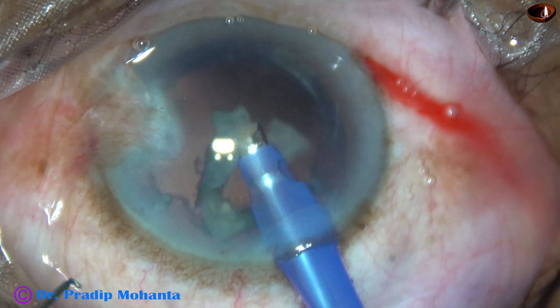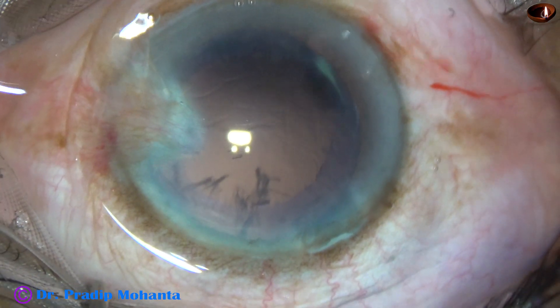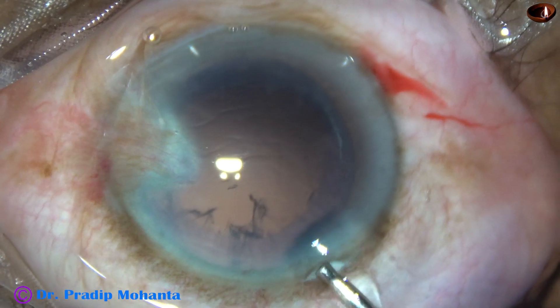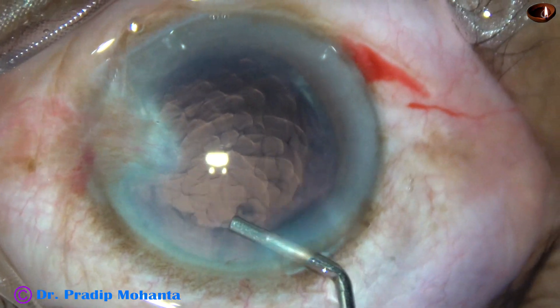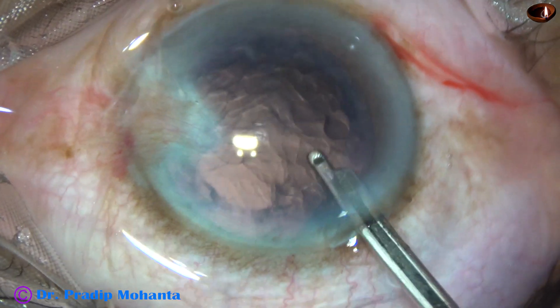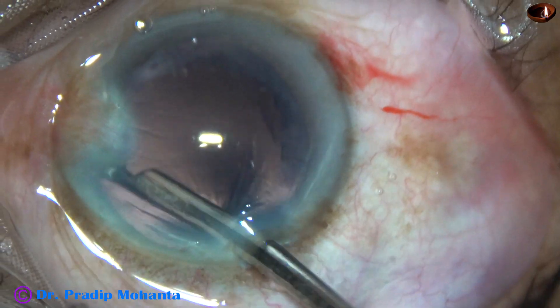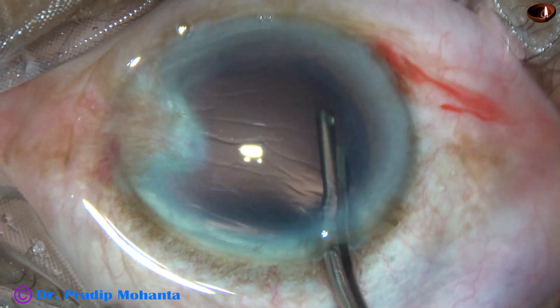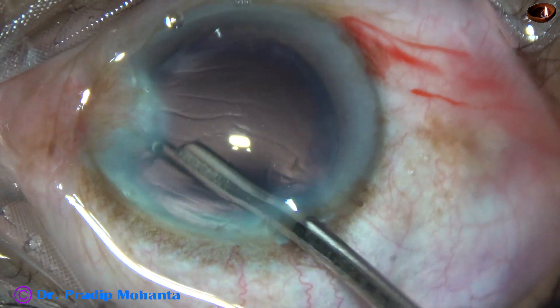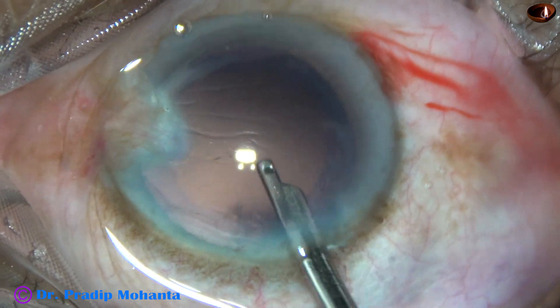But it is not so in all cases. Some brown cataracts or black cataracts have very stubborn leathery fibers. In those cases, we may not get such nice chops. Very little cortex is there in this case, and I am going to remove the cortex with this instrument. This is a 23-gauge Simcoe cannula.